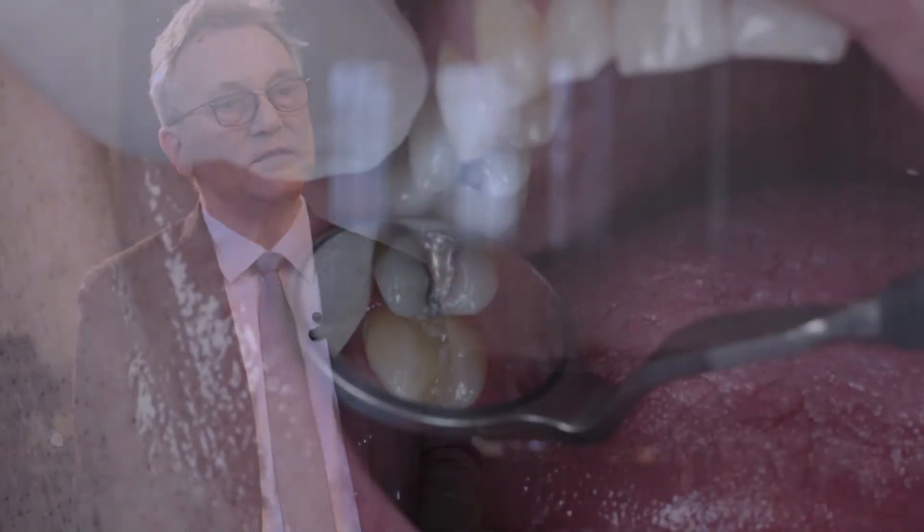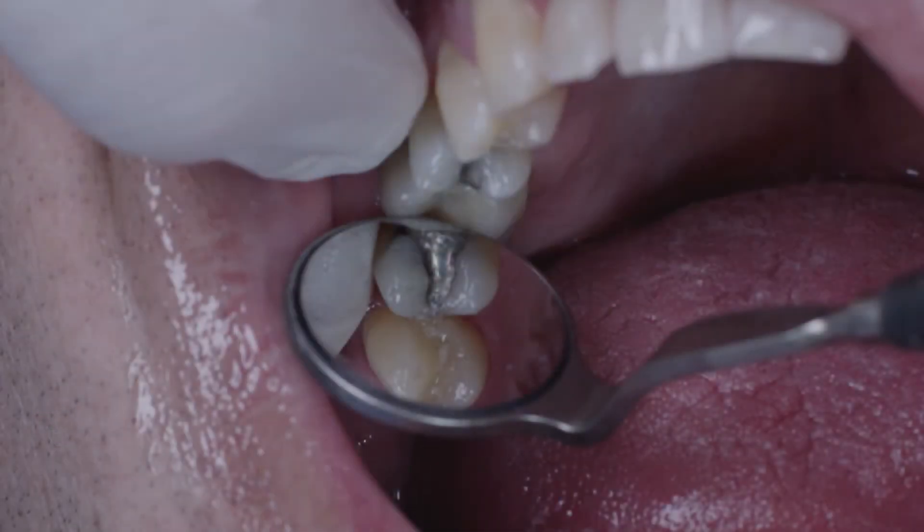A patient came to my dental office requesting that an amalgam filling in tooth 1-5 be replaced with composite. I chose Venus Diamond because it guarantees considerable stability particularly in the areas that bear occlusal load. It offers low shrinkage and outstanding handling properties.